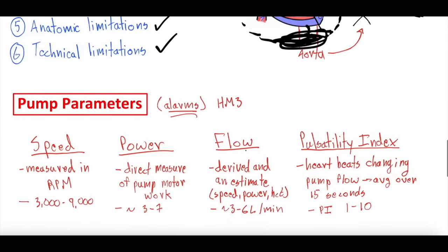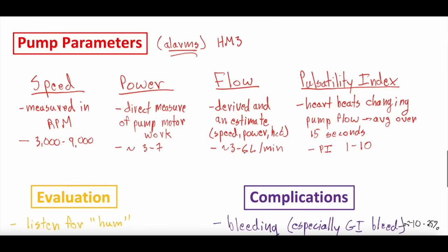Okay, so pump parameters. This is, at the end of the day, a pump. The LVAD is a pump. And I put HM3 here because these are somewhat specific to the LVAD you have. Again, HeartMate 3 is the biggest one. I also was going to talk about alarms, but I'm going to do a separate video on LVAD alarms, a deeper dive on it. So keep an eye peeled for that. We'll link it in this video's description when it is out as well.